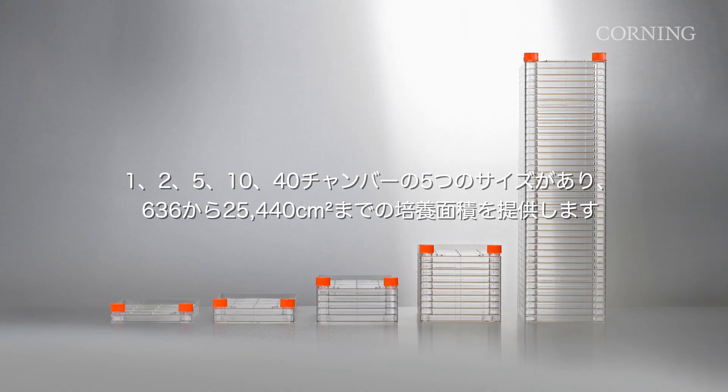It is available in 5 sizes — 1, 2, 5, 10, and 40 stacks — offering growth area ranging from 636 to 25,440 cm².